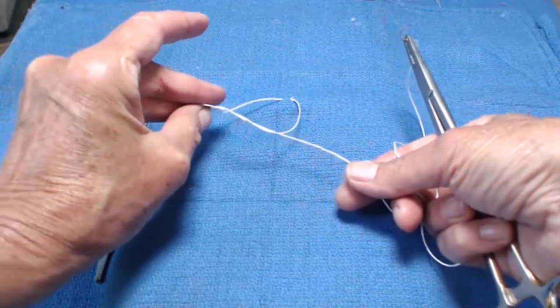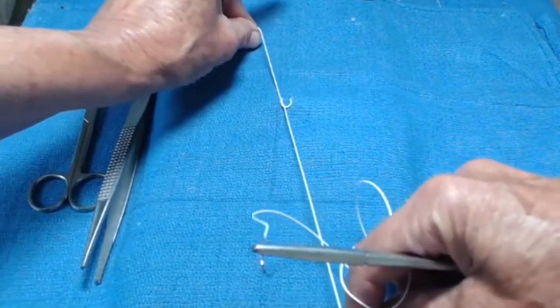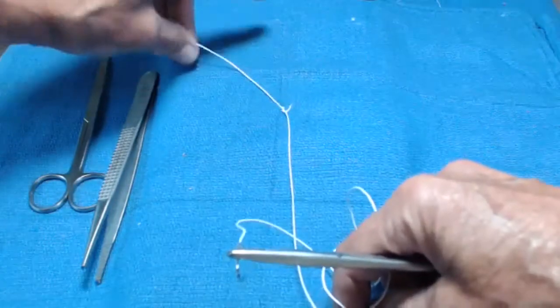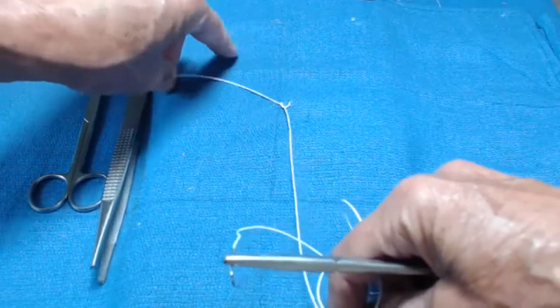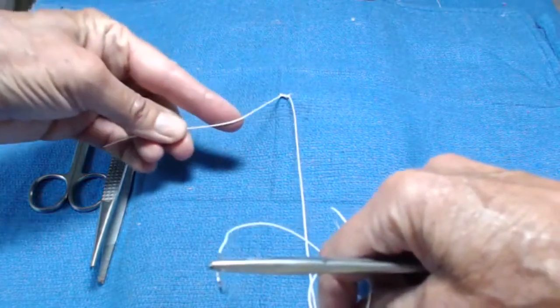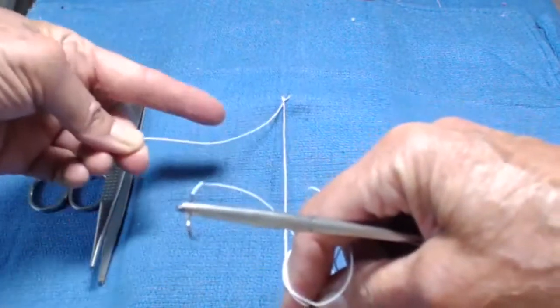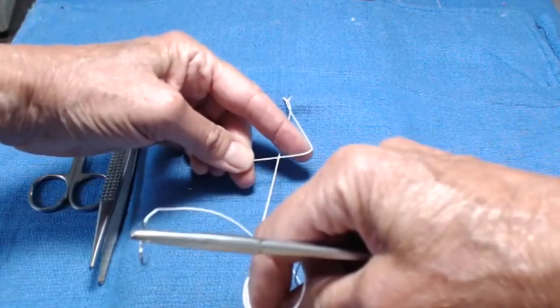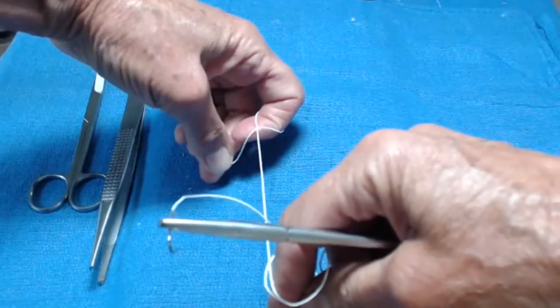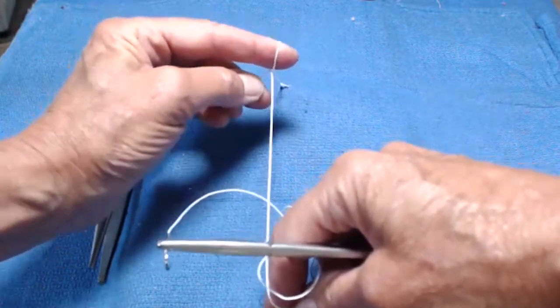I don't have a lot of tension on the suture — that is essential to make this easier. I'm now going to flip my hand palm down and bring it slightly to the left, and you can see this beautiful little half knot. I'm going to slide my thumb over, so I'm pinching the short end now between my middle finger and my thumb, and I'm going to point away and pull the suture gently until I have a nice half knot that is down on the tissue but not tight around the tissue. I'm then going to take my pointer finger, which is outstretched, and put it against the short end and make a reverse four. I'm just pushing it over again on top. This time I want it on top of the long end. So again, I have room to dip my finger in and catch the short end, bringing it up through the triangle of that four until I have a little balloon on my finger.